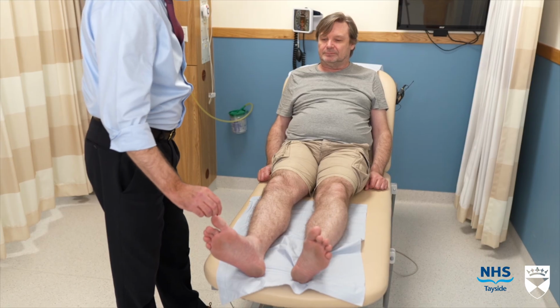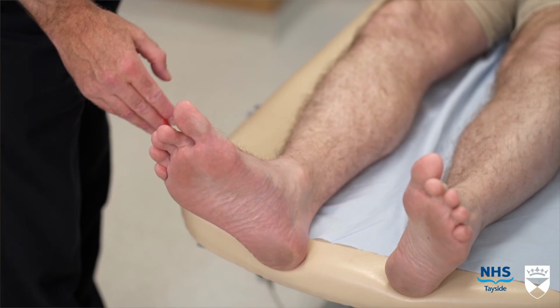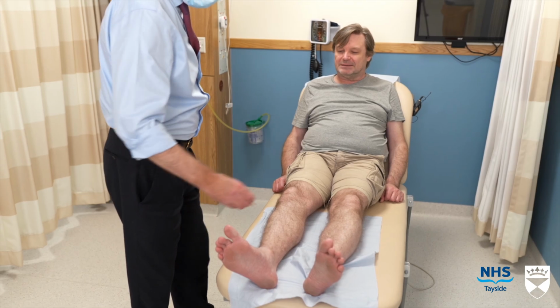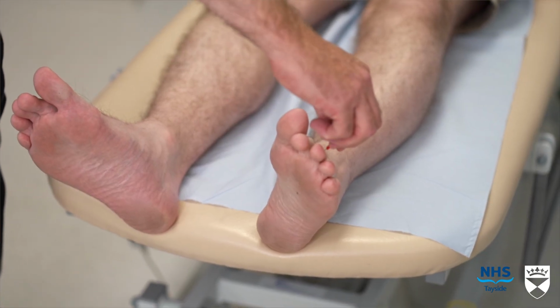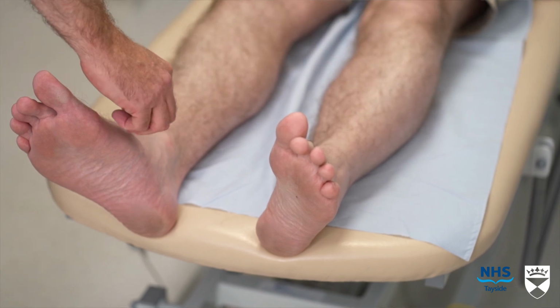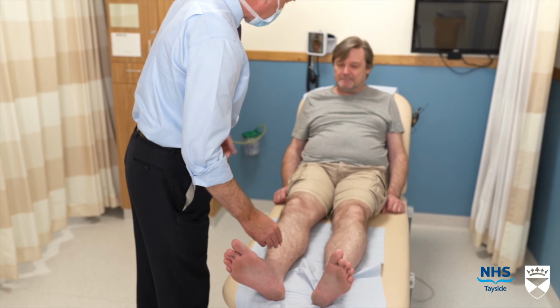Tell me when it gets sharp. Yes. Pain is tested using neurotips with the patient's eyes open. Tell me when it gets sharp. Yes. Do you feel it sharp there? Yes. Are they both the same? Yeah.